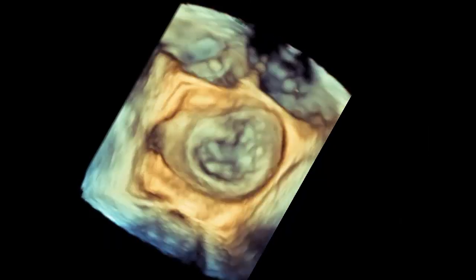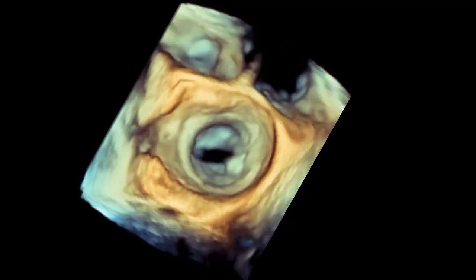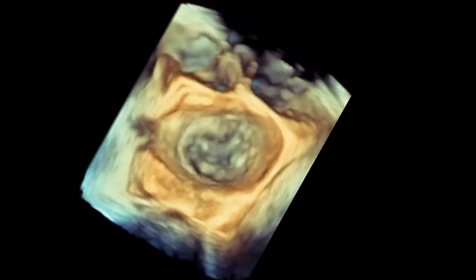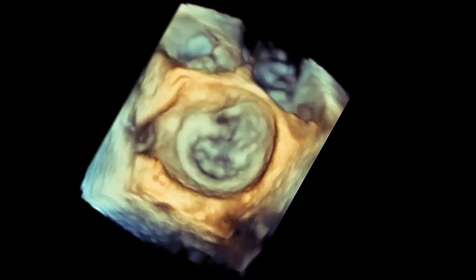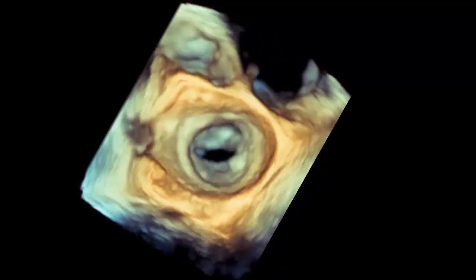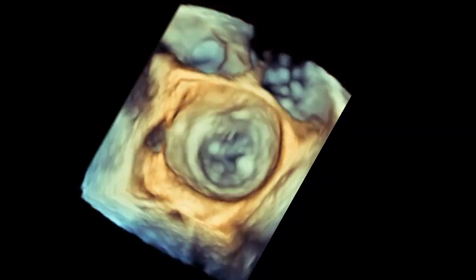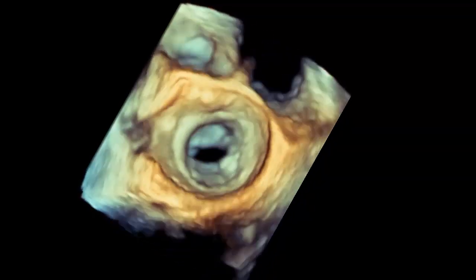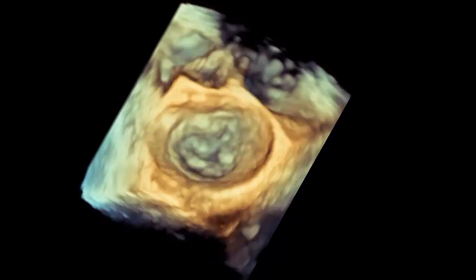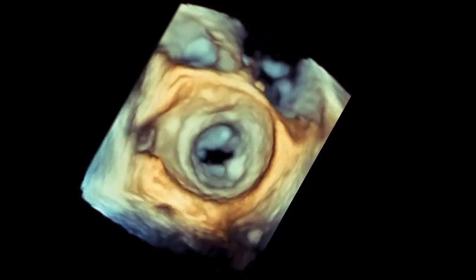With 3D transesophageal echocardiography, it is possible to evaluate the morphology of the valve and all characteristics of mitral stenosis, and it is also possible to calculate the planimetry of the mitral stenosis area.